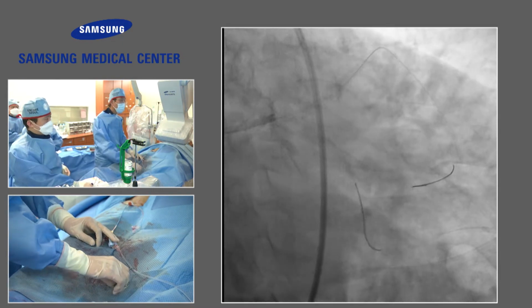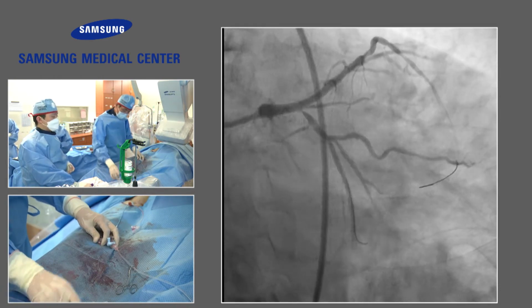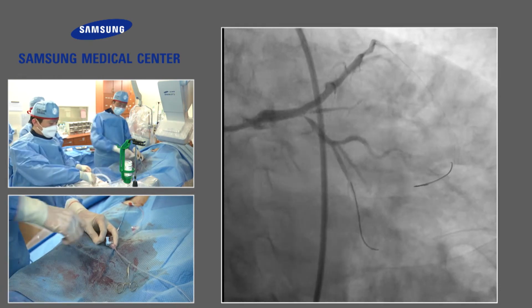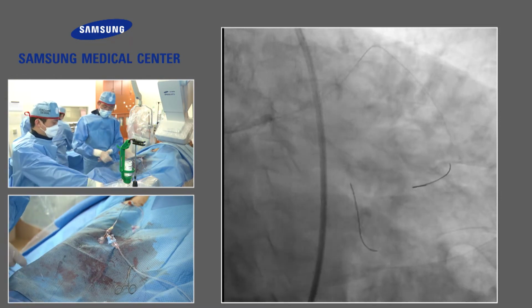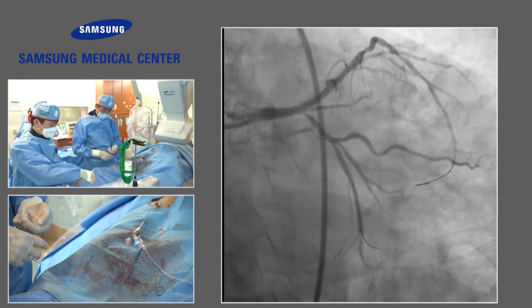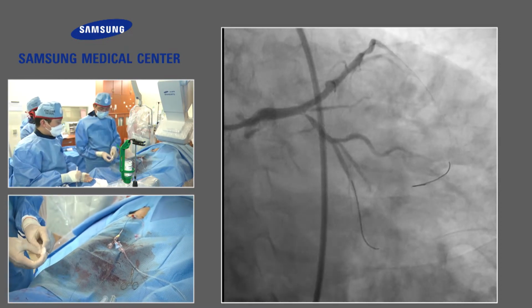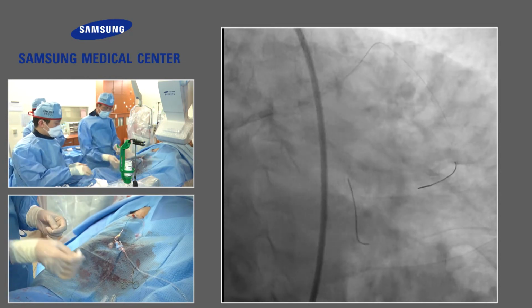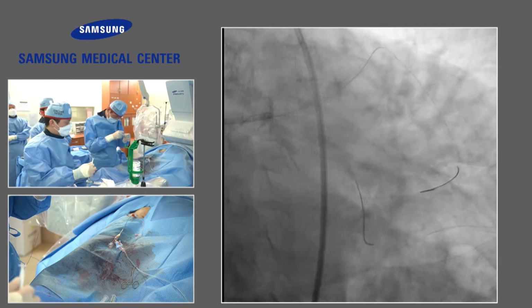So maybe we are not sure about the location of the wire. Maybe we can check the IVUS very shortly about the possible undermining. Actually, wire prolapses in the left main. I'm sure that this is true inside the stent, but if not, I'm not sure. So I check it with IVUS.